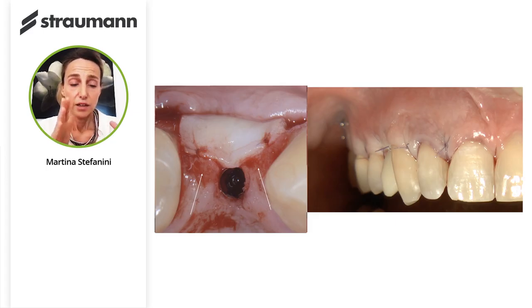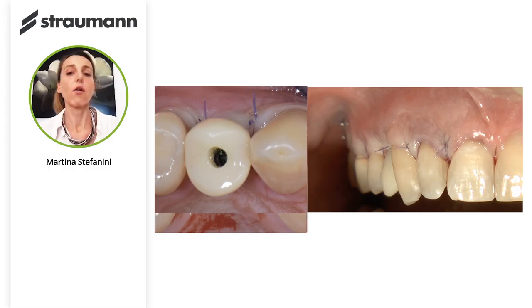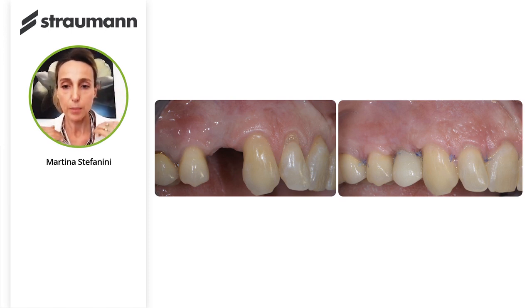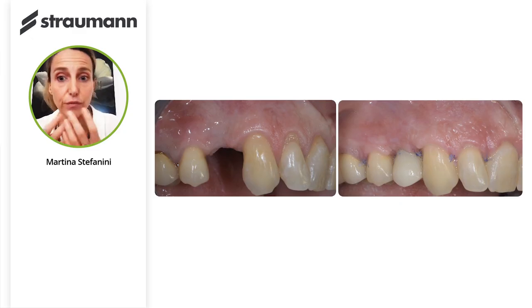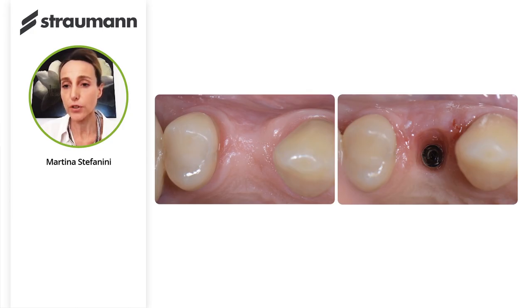As you can see, the anatomical papilla in the pictures were desepithelialized not only on the buccal aspect but also on the occlusal aspect, and then the soft tissue will be tightly adapted around the convexity of the provisional crown. And this is 2 weeks after at suture removal. You see the stability of the flap in the coronal position because the connective tissue graft helped the stability of the flap in the final position. The provisional crown helped the stability of the soft tissue in the final position. And this is, from an occlusal point of view, the transmucosal path, healthy and thick.